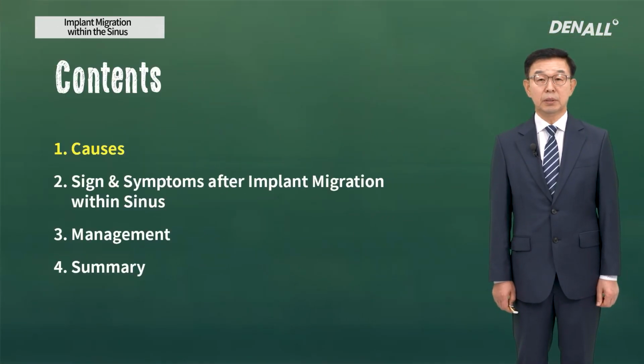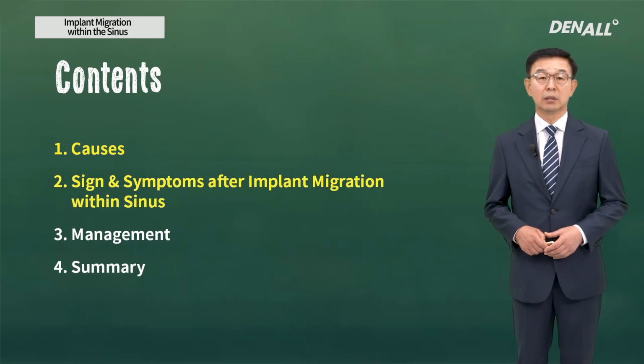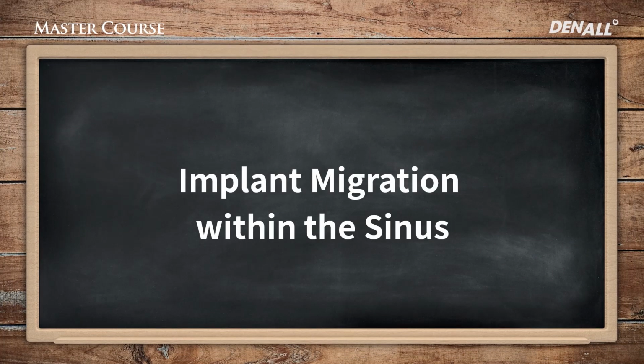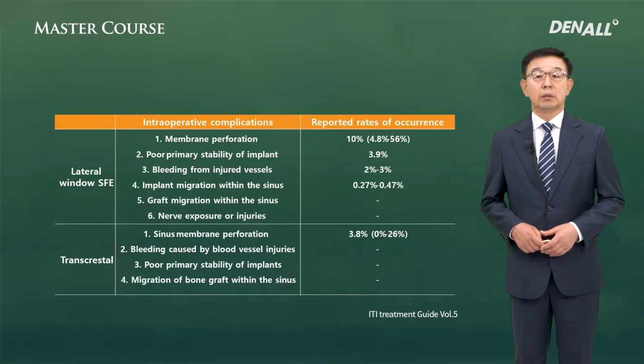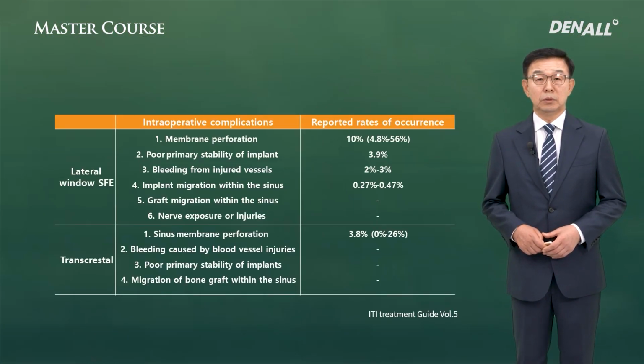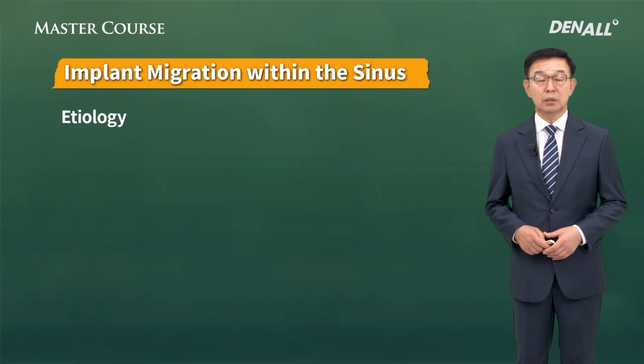Today, I'm going to look at the reason why the implant migrates into the sinus, the symptoms, and how to manage this problem. When you do lateral approach, at times, the implant can migrate into the sinus. Let's look at the cause.